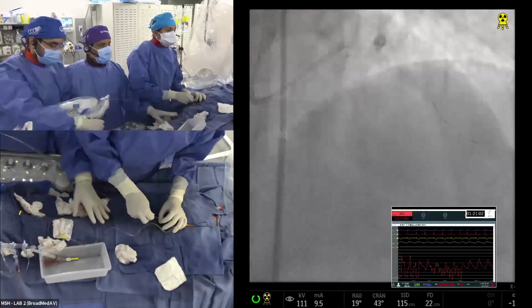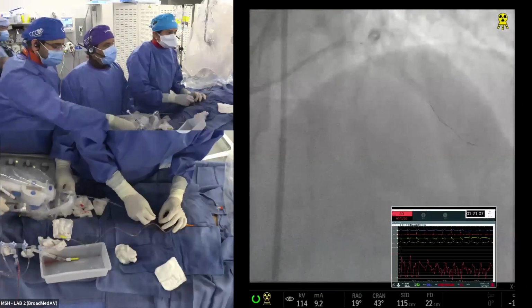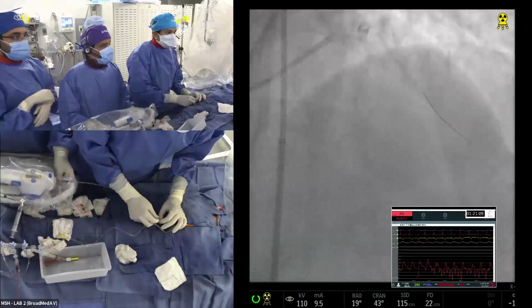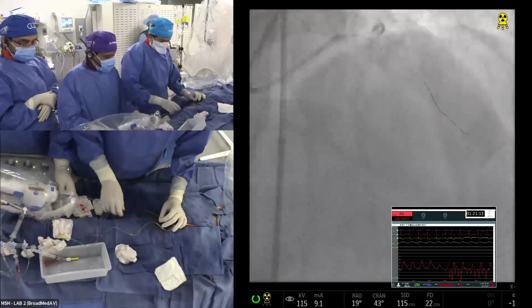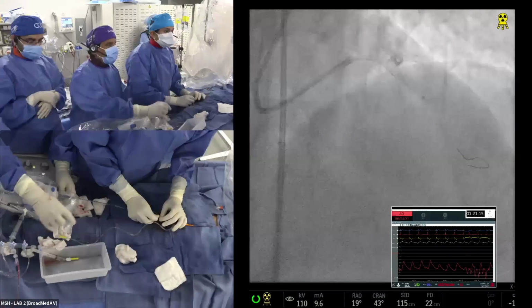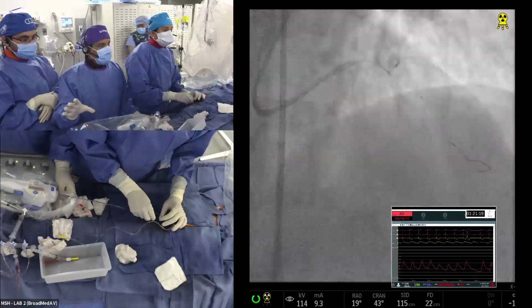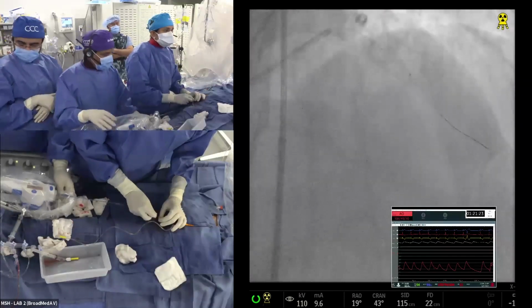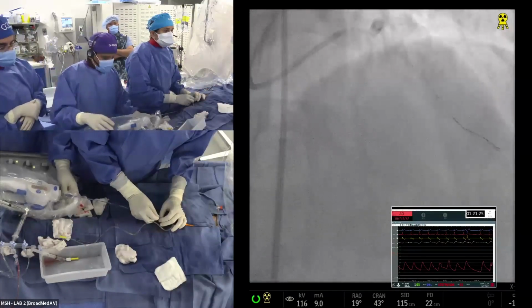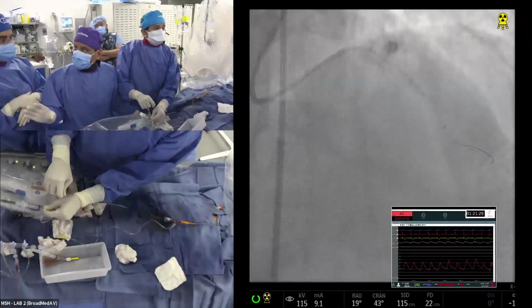But as I said, we do the highest number of rotablation globally. Nobody comes close. What number do we do? About 60, 65 per month at Mount Sinai, and I can tell you we have never had a situation, because we approach it exactly as I spoke: if there's a very tough lesion, you take care of the side branch first and then you do the main, and after the atherectomy we do a balloon many times, so that the lesion is stable.